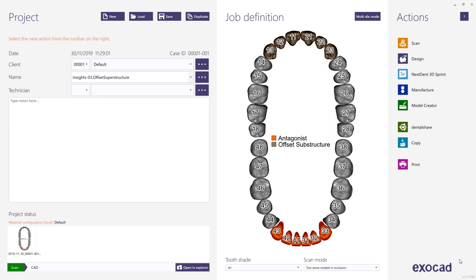Hello. In this video we will design an offset substructure on a bar. We have already designed the bar in another session. After designing the bar we have milled and re-scanned it.